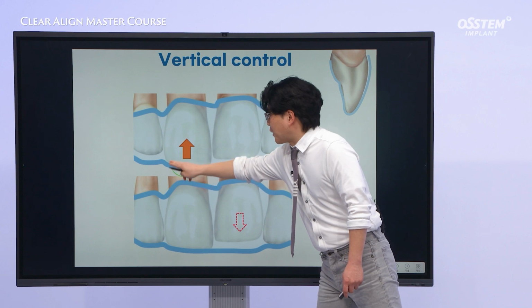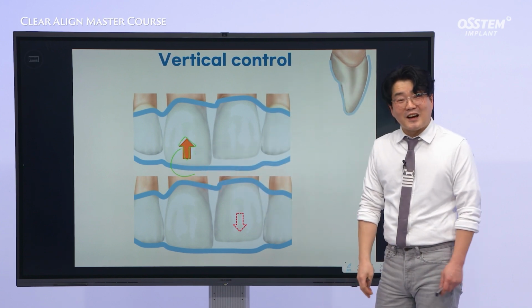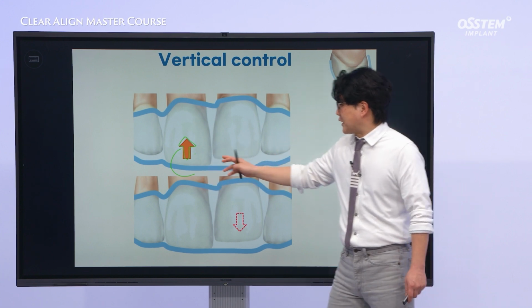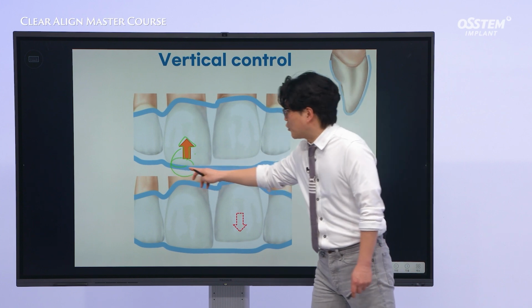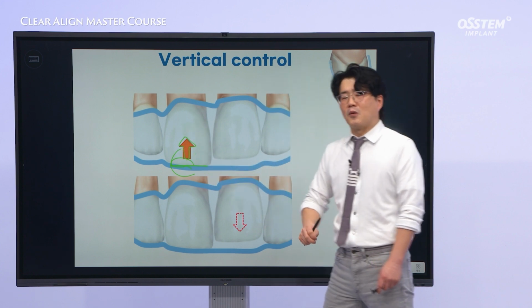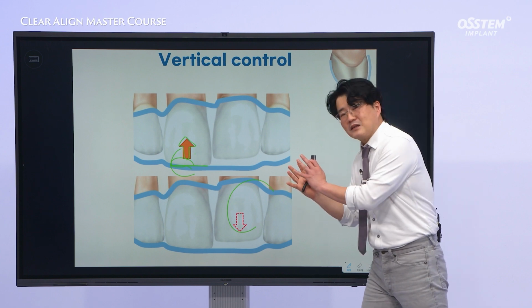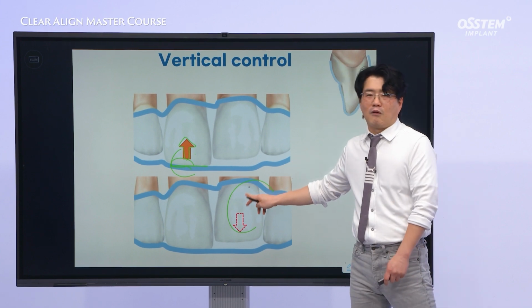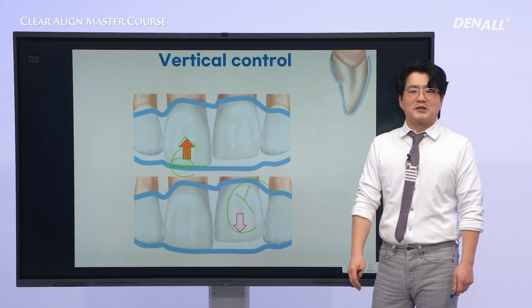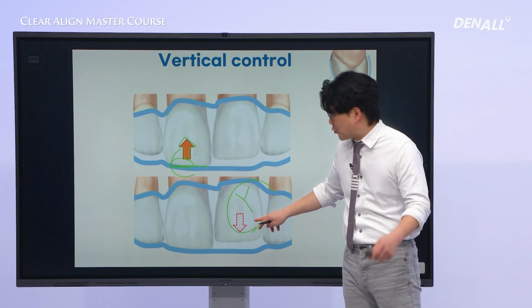You might be thinking, oh, this is a little bit easier because it's a solid line. With an aligner, we are using the pushing force on this incisal edge. So, we will push in the tooth. It seems easier. Now we will pull out a tooth stuck inside. But when trying to pull it out, it will just slip. Not easy, right? In this case, of course, neither of these are very easy, but anyway, if you compare them, pulling the tooth out is a little bit more difficult.